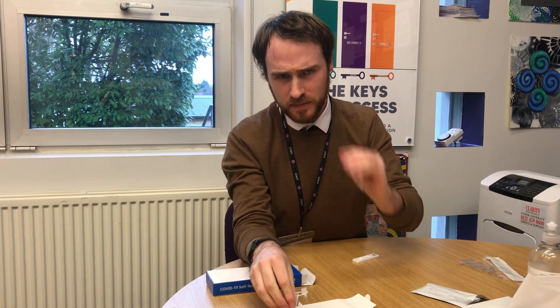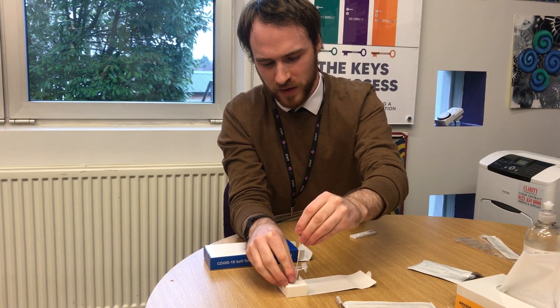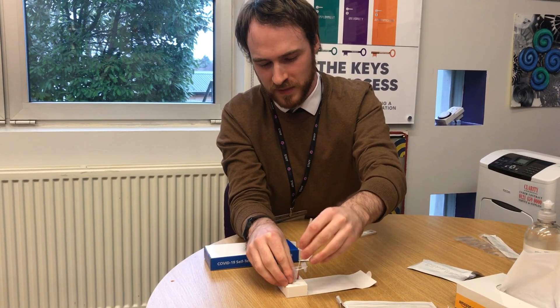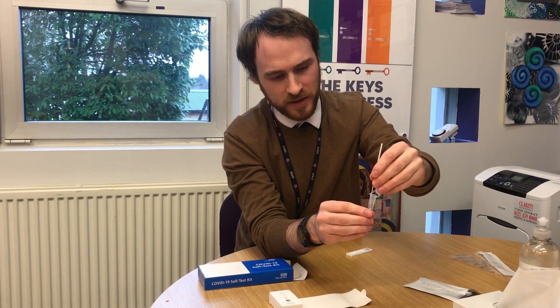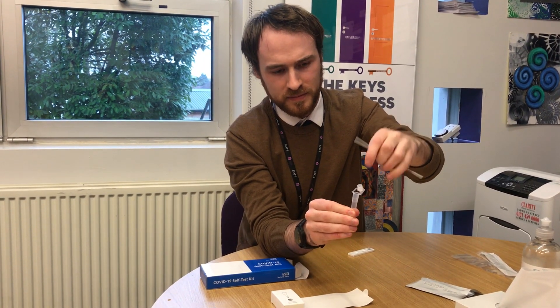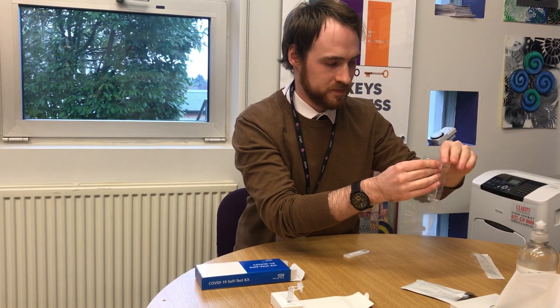Take the swab and put it into the vial with the extraction fluid quite forcefully, and revolve it around — roughly about 15 seconds. On the way out, to make sure the test is as accurate and effective as possible, just squeeze and pull it out. Place the vial back in the holder and continue popping the waste into the bag.